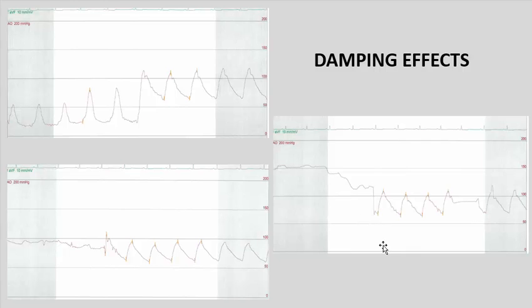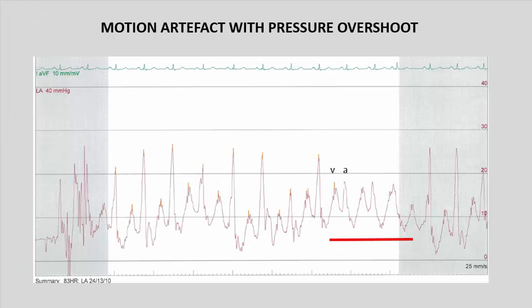You learn to recognize these over time, and it's important to make the cardiologist aware because you'd be surprised how focused they can be on the X-ray screen, and they're relying on us to be their second set of eyes and ears and listen and look for any of these artifacts. Not necessarily artifacts, real changes due to possibly dangerous positioning of the coronary artery.